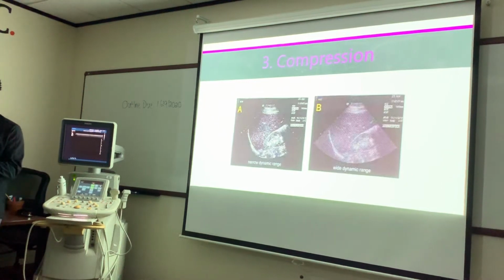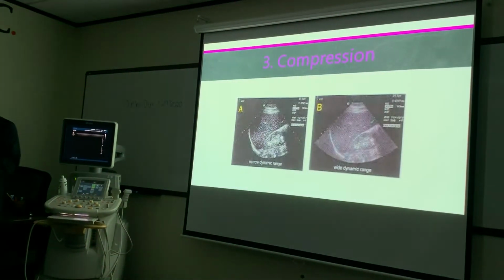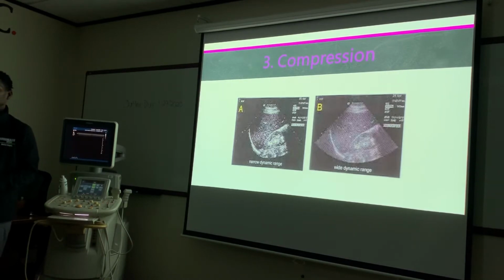The range of shades being displayed is narrow. It's only displaying black and white, basically. Okay? Well, we have a wide dynamic range where it's displaying a lot of shades of gray.